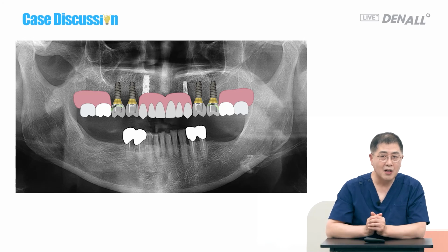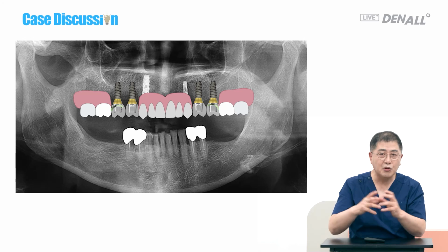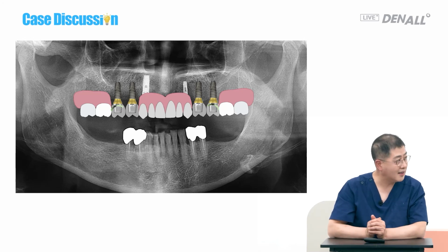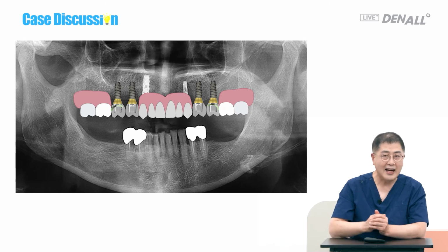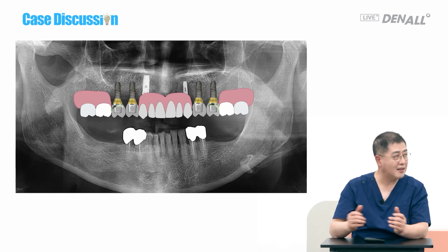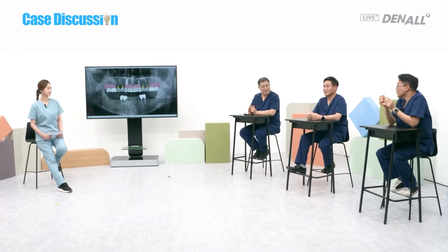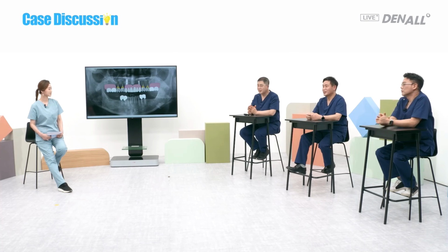If it is not properly done, the neutral zone can be invaded, which is a problem. So we need to be careful about it. This is good to use when teeth were extracted just a short time ago. Thank you very much for the good tip. The tissue supported and the implant supported, basically the RPD process is the same, isn't it?